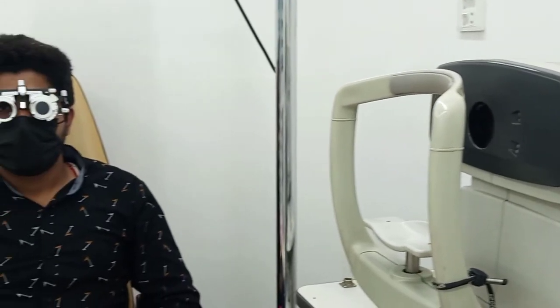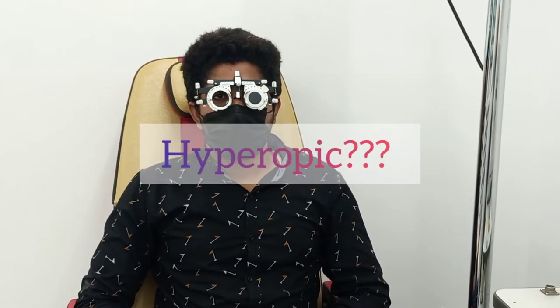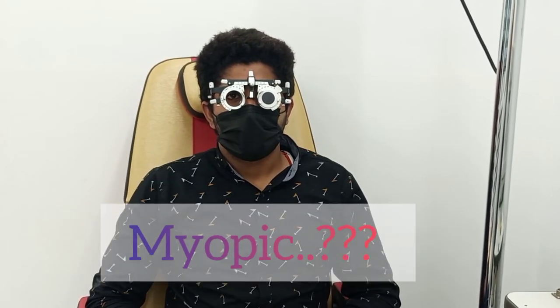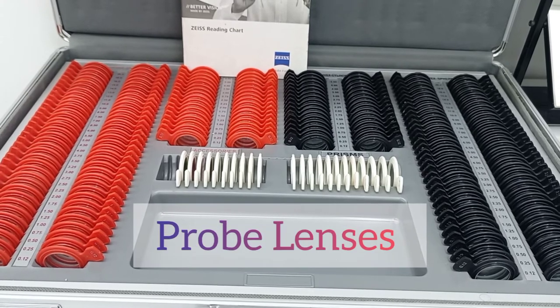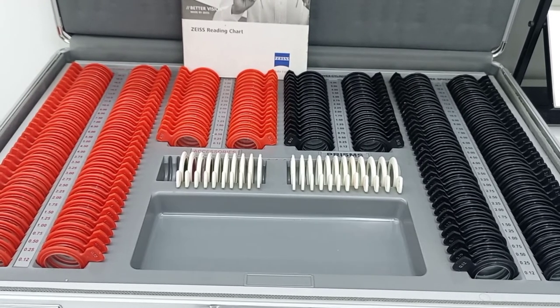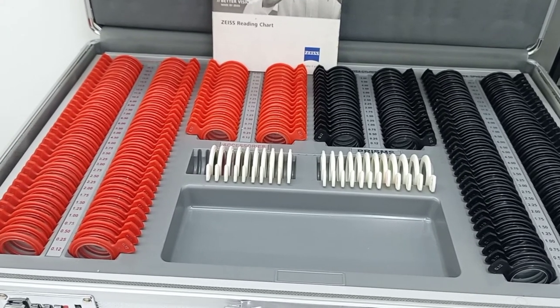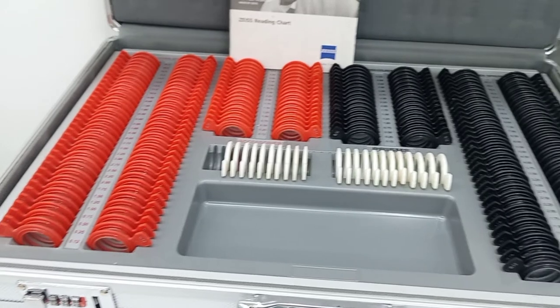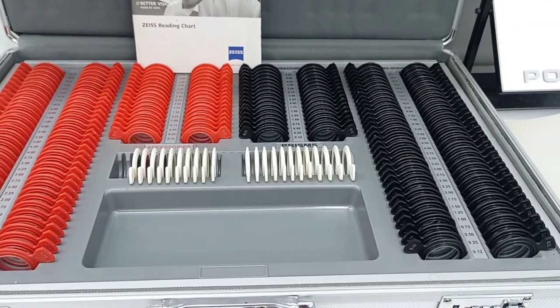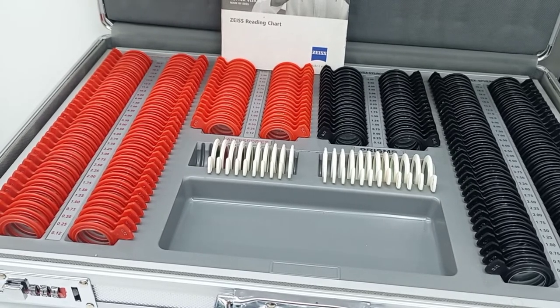Right now we don't know whether our patient is hyperopic and requires plus lenses, or myopic and requires minus lenses. For this we need probe lenses. Probe lenses are the lenses used to establish the best vision sphere, and they can be of any power — either minus or plus. The power of the probe lenses depends upon the visual acuity of the patient.